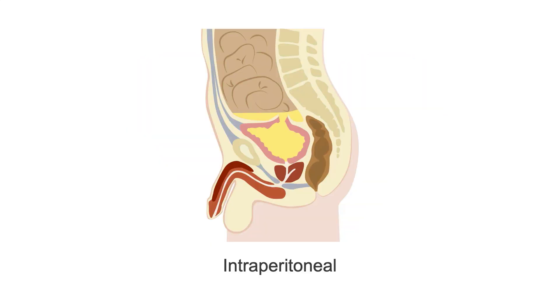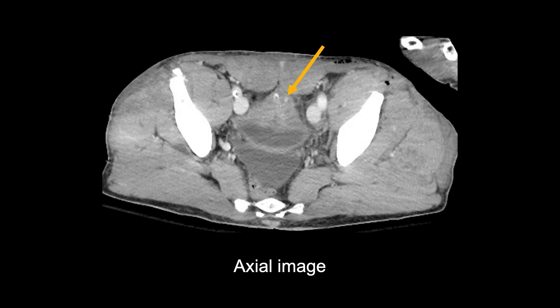With intraperitoneal rupture, the bladder often becomes decompressed after rupture. Since the injury is at the bladder dome, it can be difficult to see on imaging.